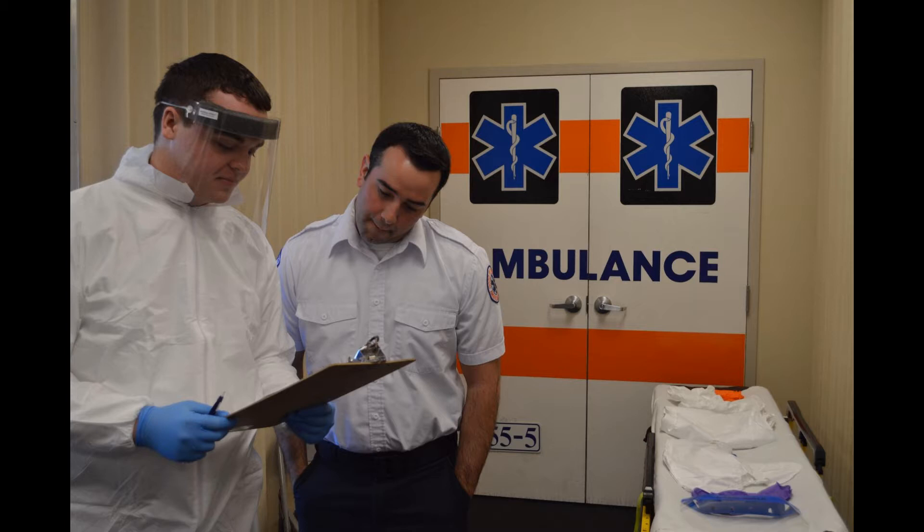When donning PPE, it is important to engage a trained observer to ensure the PPE is donned correctly. Again, this trained observer may be your partner. A checklist is helpful in ensuring the proper sequence is followed.